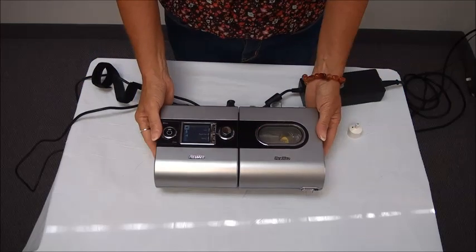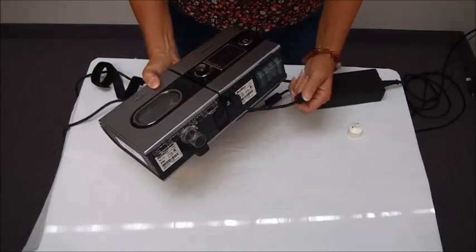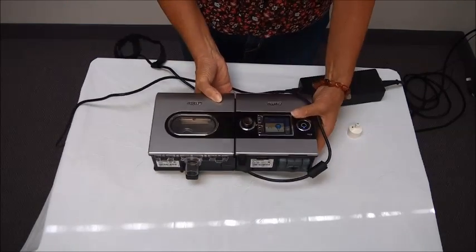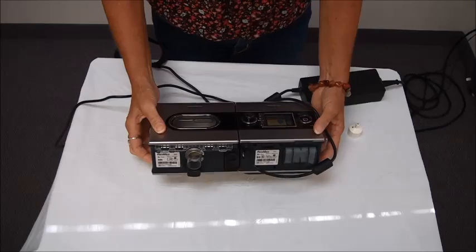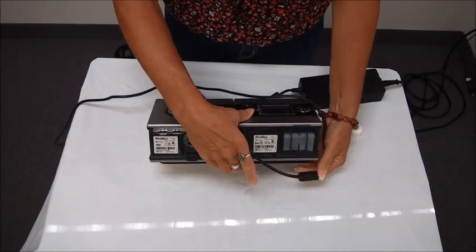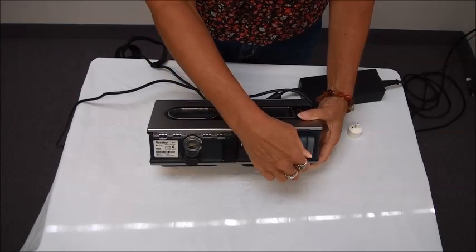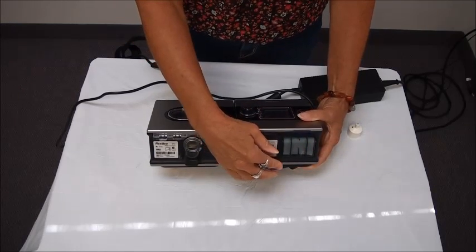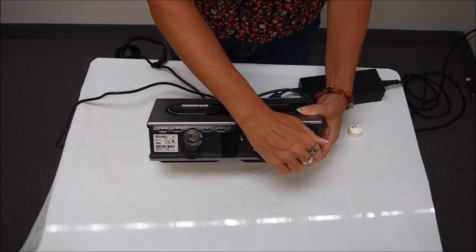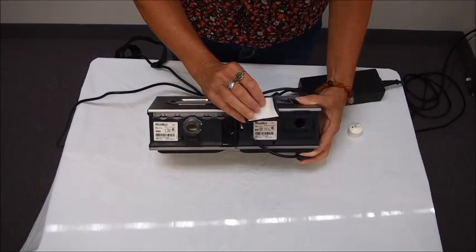That's what I have right in front of me here and the first thing I'm going to show you is the back of the machine itself. Starting over on this side of the unit, right on the corner here is your filter and this is the filter that is going to protect the air inlet of the machine from any dust and particles that would come through.